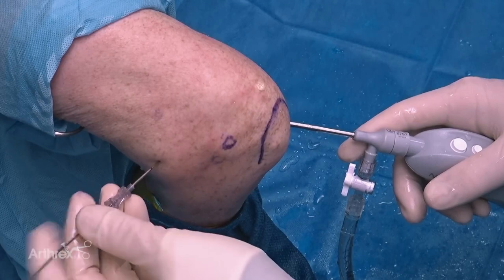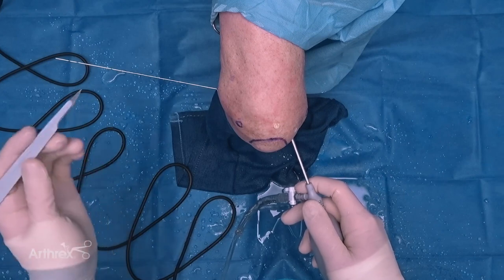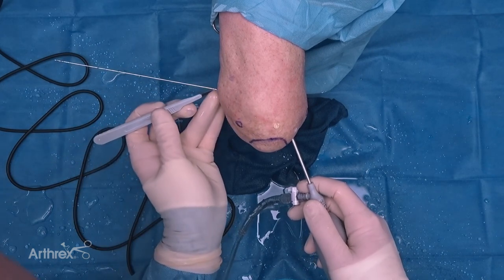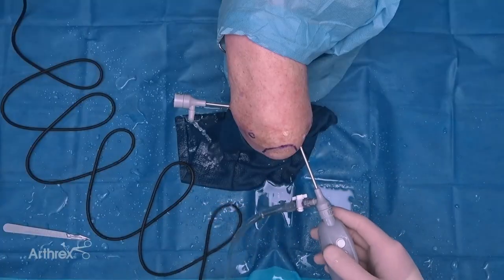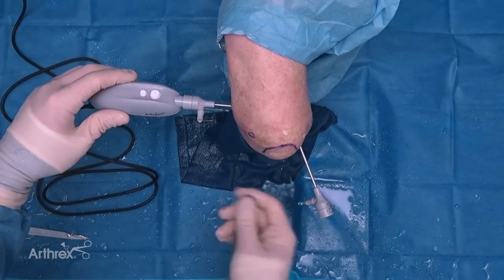This is the way that you can confirm your placement before you make an incision or start to pass any instruments. This is a cannulated instrument, so I'll take the trocar out and place a small guide wire, then remove the needle and leave the guide wire in place. Make a small nick in the skin - this is a 1.1 millimeter guide wire and I'm going to insert a 3.2 millimeter cannula, so just the smallest little nick here in the skin. Then take our nanoscope cannula and insert it over the top - now our cannula is in the front of the elbow.